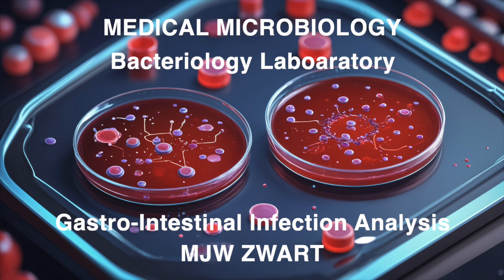Right. We'd start with that GE-PCR panel again, of course. But we also got to look at our roadmap for other culture needs. And because it's bloody diarrhea, we'd be thinking about Shigella and Shiga toxin-producing E. coli, right? Bingo! STEC, especially E. coli O157, that can cause some serious problems, so we have to be careful. We'd want to order that specific STEC PCR test and be ready to culture on SMAC, BLD, and CLED agar if it's positive. Okay, so let's say that STEC PCR is positive and it's growing on the plates. What's next? Time for more code breaking.